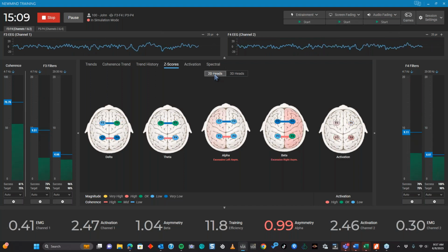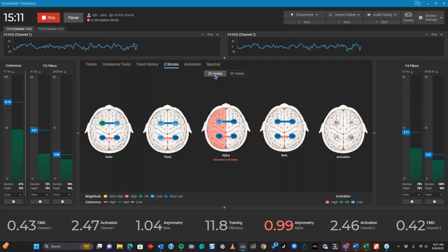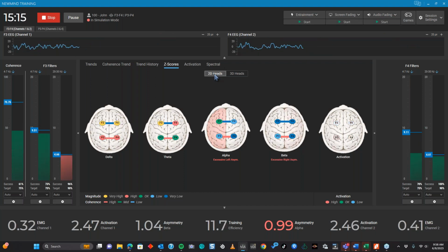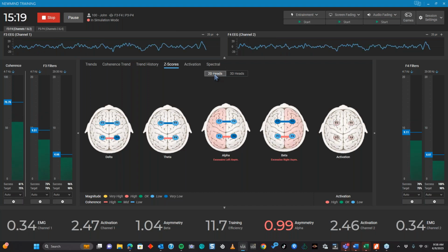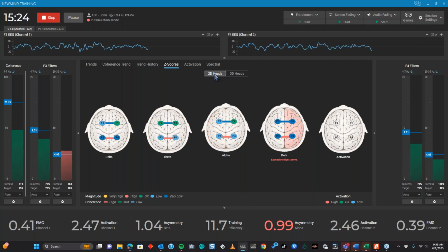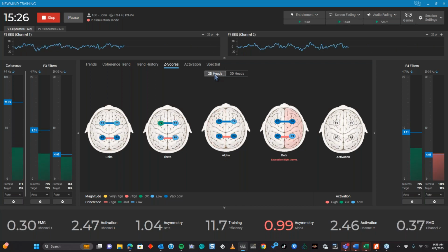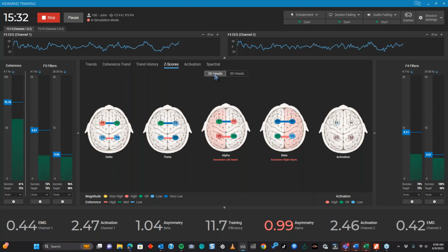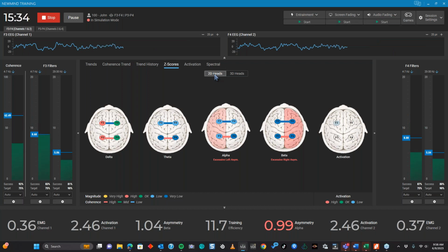Nine times out of ten, if you do a map comparison and look at the dials, in most cases you're going to see about a 70% reorganization going on, and maybe only 20 or 30% normalization. That's just the brain moving things around and kind of cleaning shop before it can actually put stuff where it needs to be.